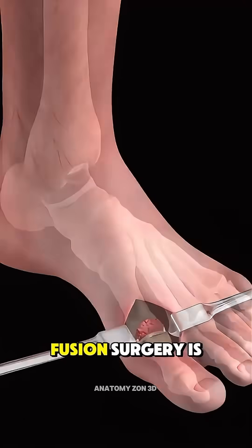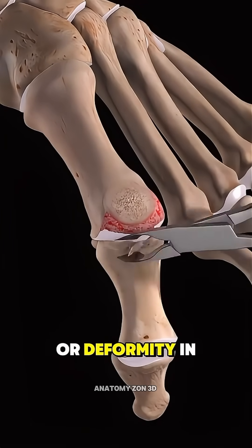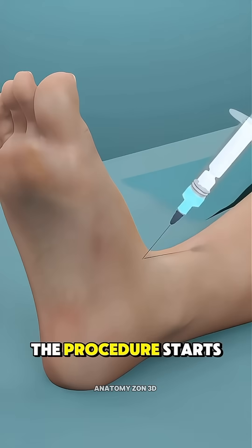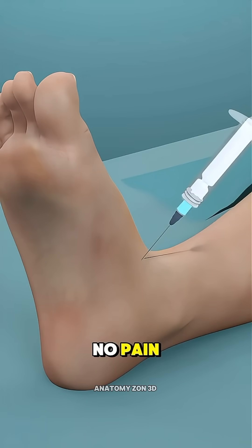Big toe MTPJ fusion surgery is performed to treat severe arthritis or deformity in the joint at the base of the big toe, called the metatarsophalangeal joint. The procedure starts under regional or general anesthesia so you feel no pain.